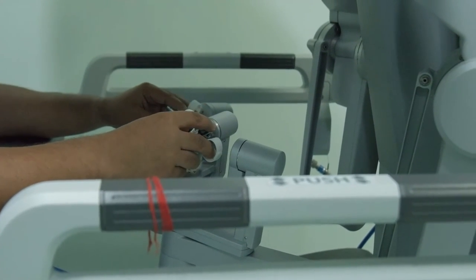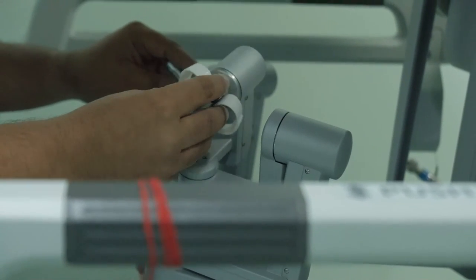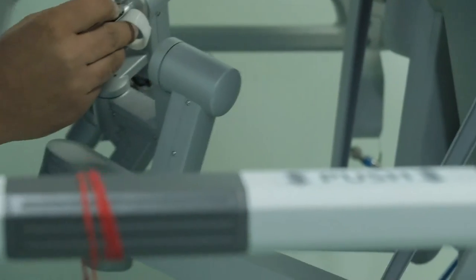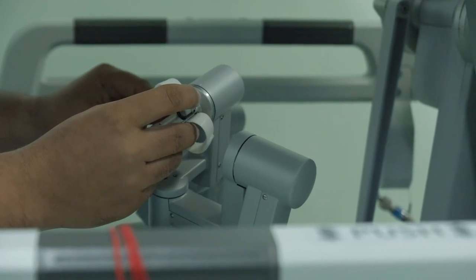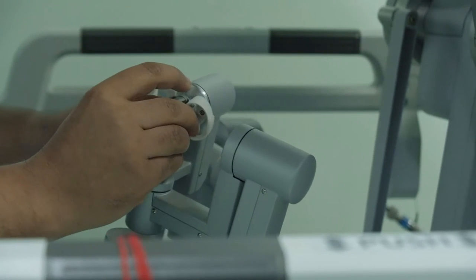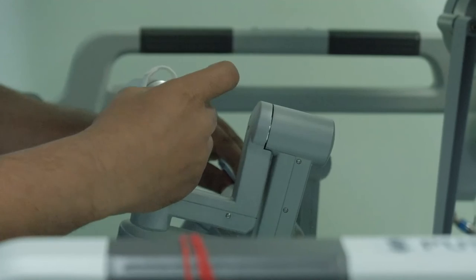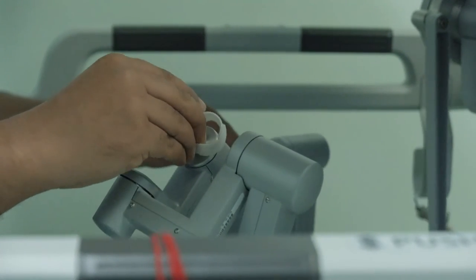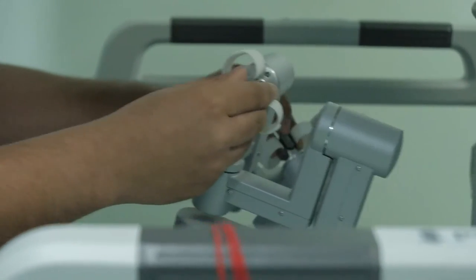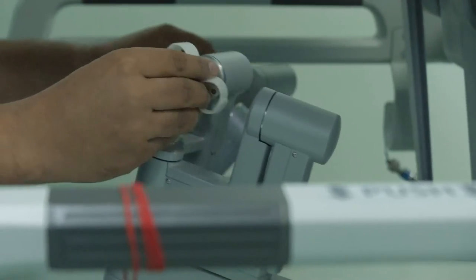If we concentrate on the hand controls here, these are the finger clutch buttons. Once you press the right finger clutch, the hand control is free without moving the tip of the instrument, you can move the hand control. If I press the left finger clutch, I can move the left hand control without moving the tip of the instrument. And if I want to make both of them free, I press the clutch pedal and both the hand controls are free. So individually also, you can clutch and you can clutch both the instruments together as well. Either you can use all the four arms, or in some procedures you just need to use three arms. Accordingly, you can set up your system and do the procedure.